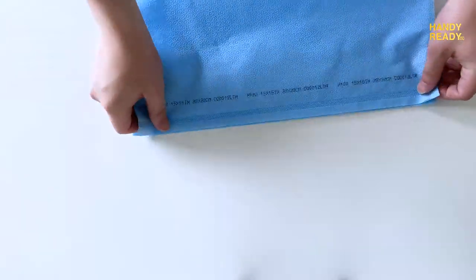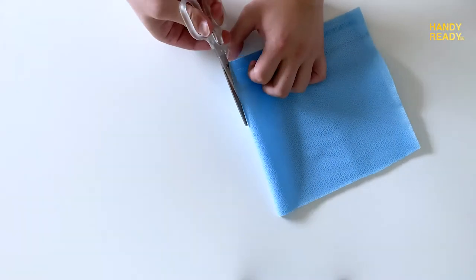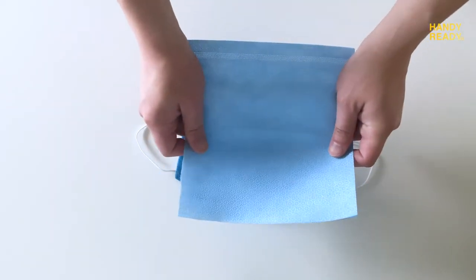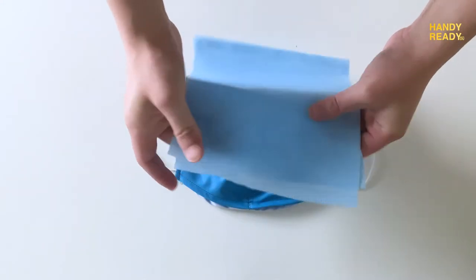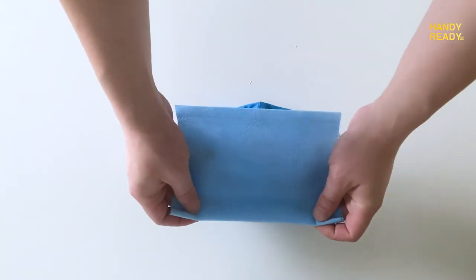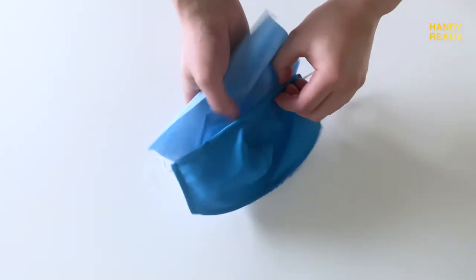Putting in a sterilization wrap as a filter is easy. First, cut the wrap into quarters. Then measure and fold the split end to meet the height of the mask. Slip the wrap into the pocket of the mask, leaving the sealed end on top, and make sure the four corners are sticking out.